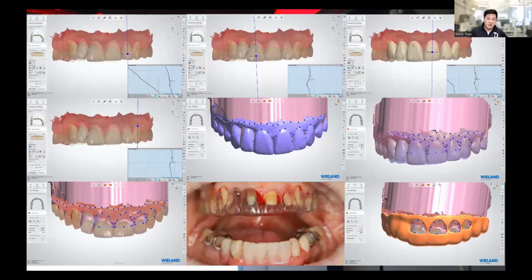So of course, once the periodontist signs off, back in the day, what I did was I would use a custom tray module to create these reduction guides, the crown lengthening guides. What I find nowadays is that the edges of these custom trays weren't really that accurate to where they wanted the final crown lengthening proportion to be. So what we do nowadays is we just use a suck-down thermoform and make a clear Essix retainer with some windows that we cut out, and we send that, and it's actually been a much better result.